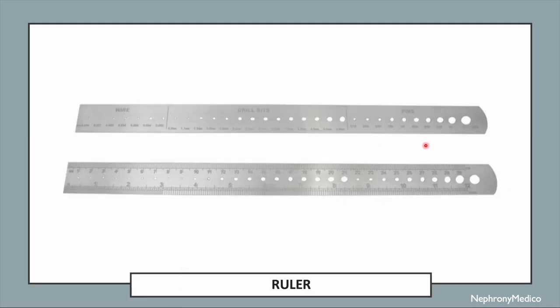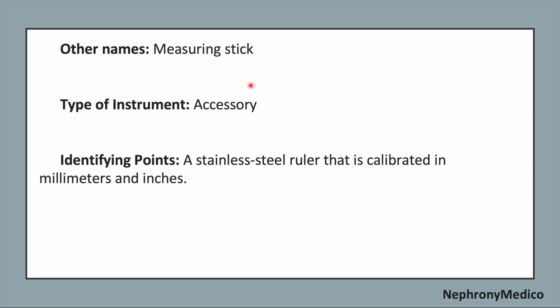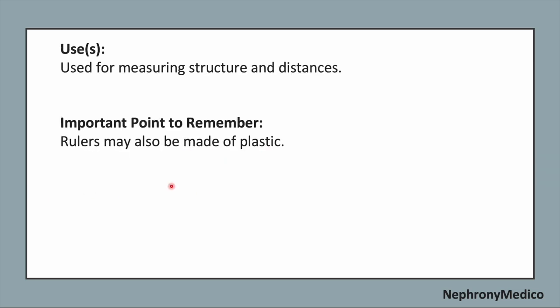This is a picture showing a ruler. Now, the other name of this instrument is measuring stick. It is an accessory type of instrument. Now, identifying points: a stainless steel ruler that is calibrated in millimeters and inches. Use: it is used for measuring structure and distances. Now, important point to remember: the rulers may also be made of plastic.